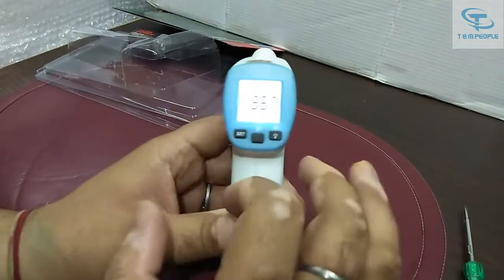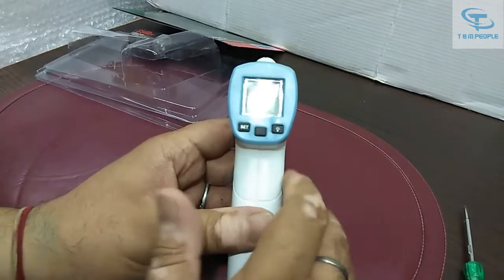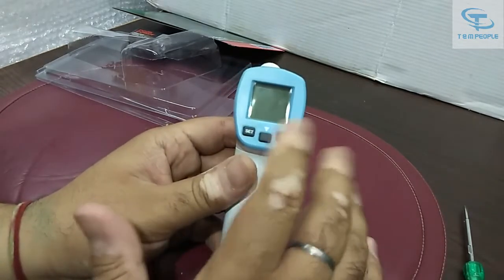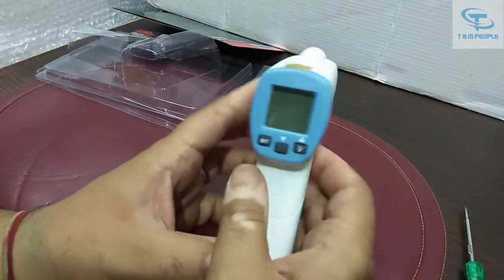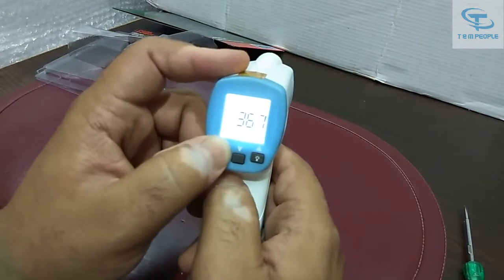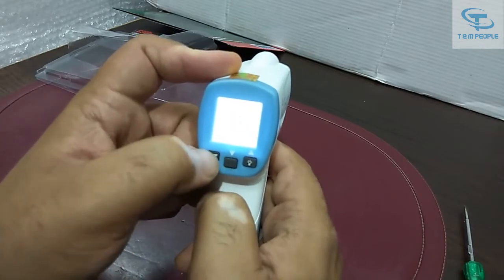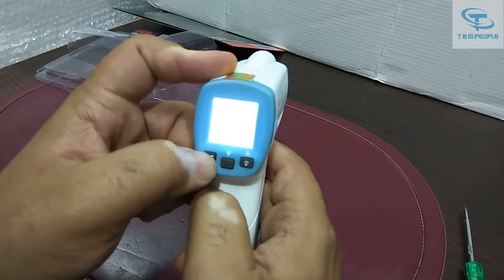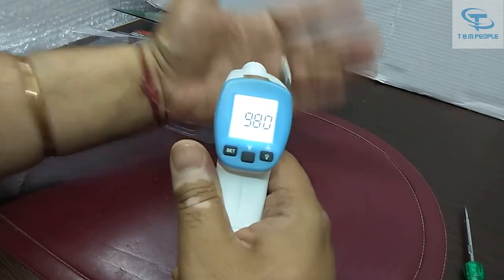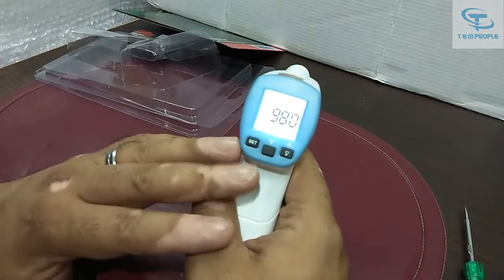It is showing 36.7 degrees Celsius. The reading is in degree centigrade, but in India we typically measure in Fahrenheit. To change from Celsius to Fahrenheit, you switch on the meter, press the set button, then press the lower button, then press set again. Now it will show the temperature in Fahrenheit — it is showing 98.0 Fahrenheit.